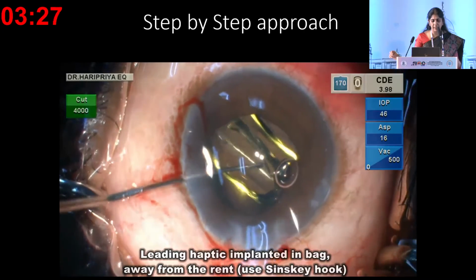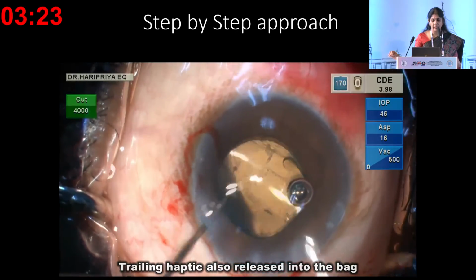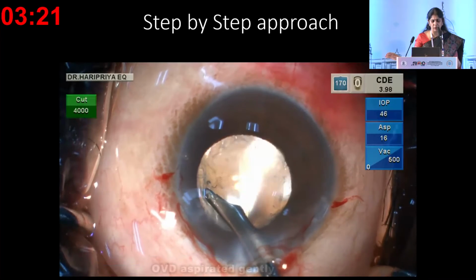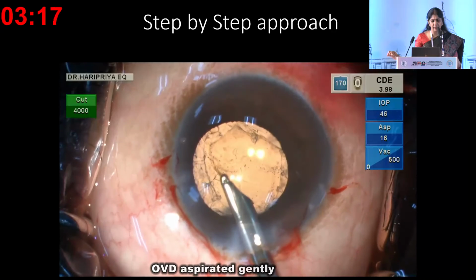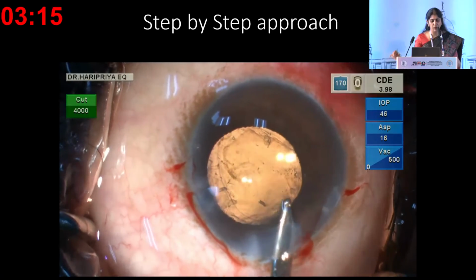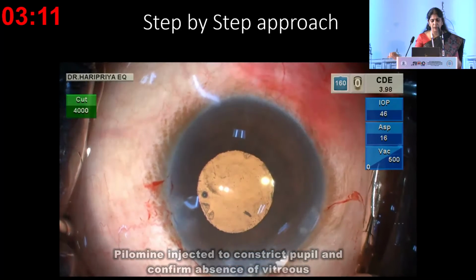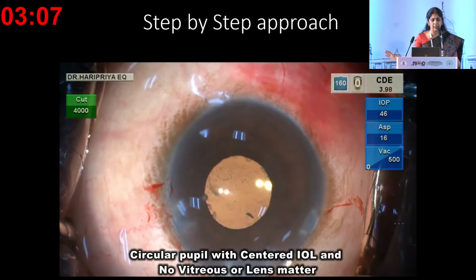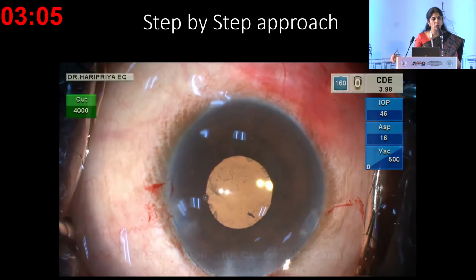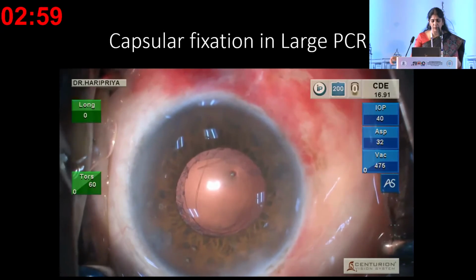So extend the incision, and like I said earlier, just flex the haptics and place it away from the area of rent. And the cortex is removed again very gently. You want to have a stable chamber, but don't overhydrate when removing the viscoelastic. That is important. So like I said, the goal is to ensure that the rent which we had initially is not enlarged. Finally, I would like to use pilocarpine as well, just to prevent any kind of vitreous prolapse in the post-op period, and to check for any vitreous on the table as well.